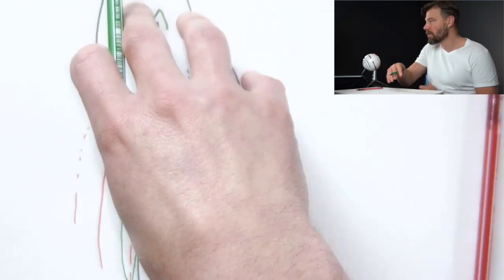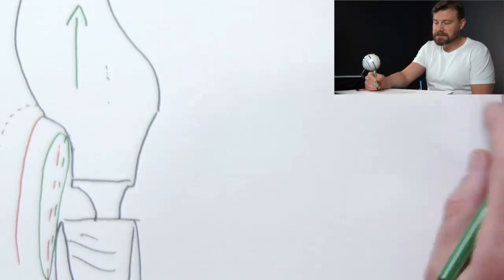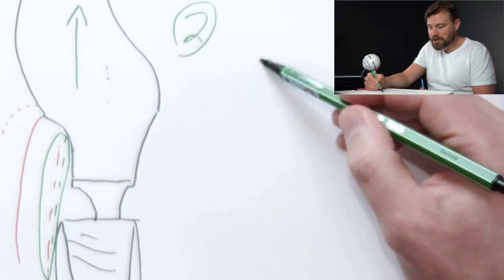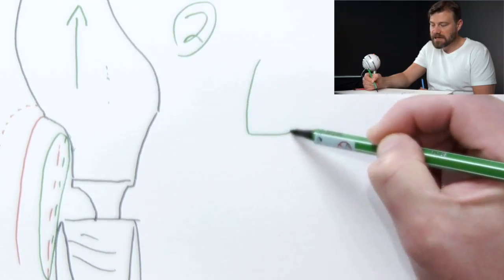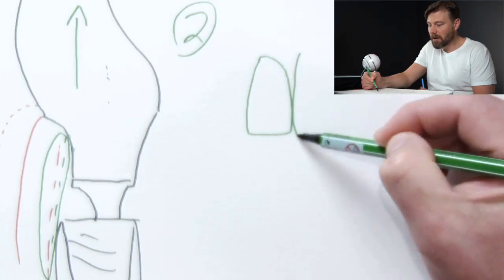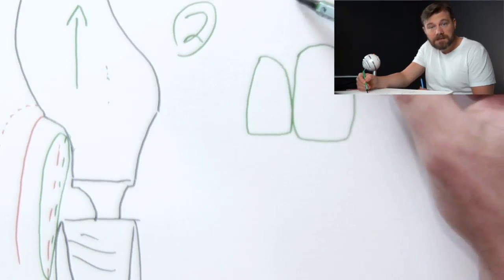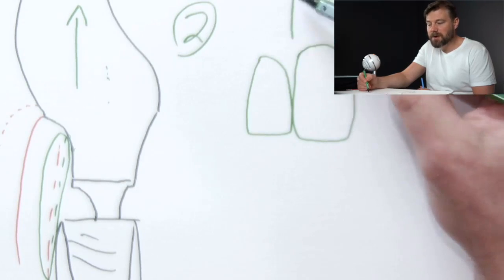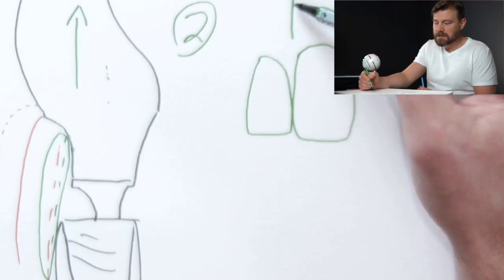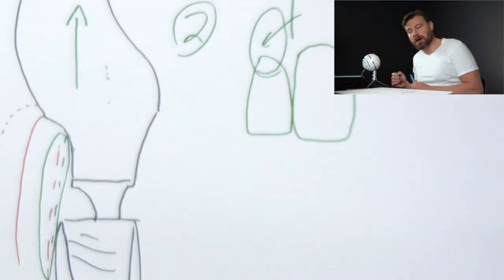If you are not able to remove the crown from place, maybe you're going to use the second option, that is a lateral approach on this area. So instead of going through the sulcus, you can opt to go to the lateral area, doing a vestibular incision in apical coronal direction, full thickness, to access this area by lateral approach.